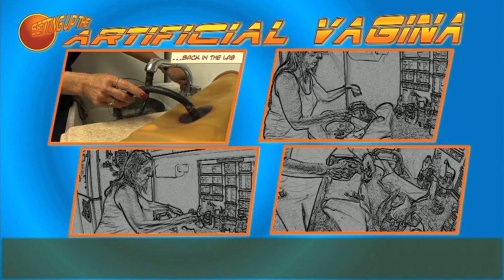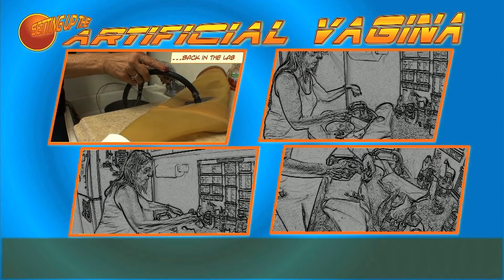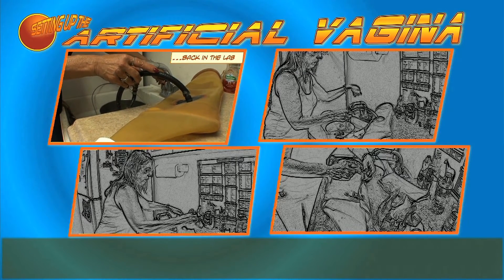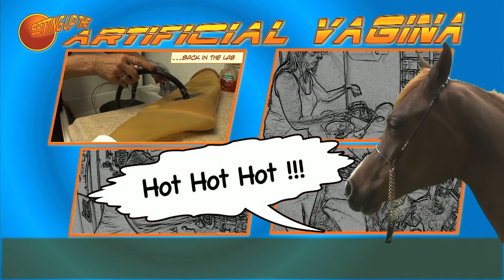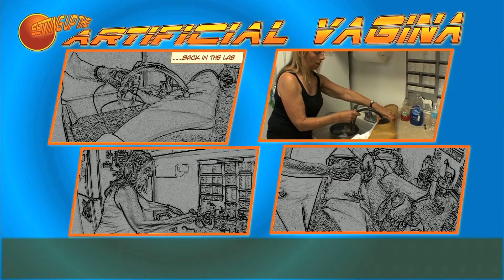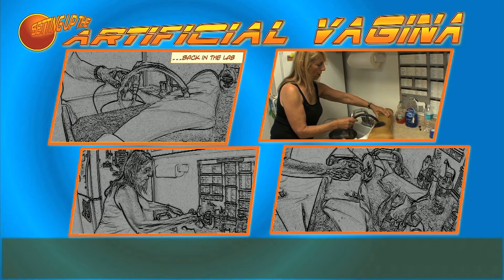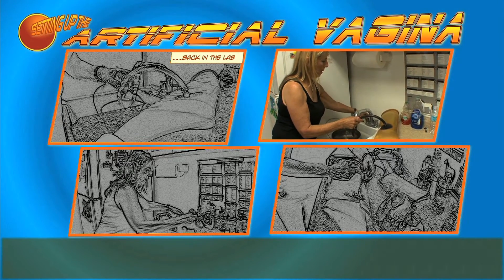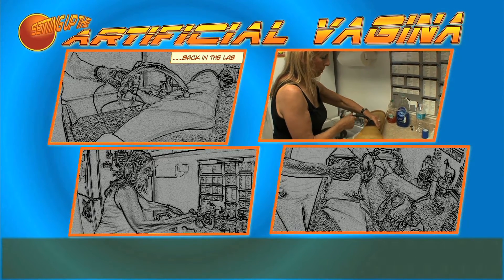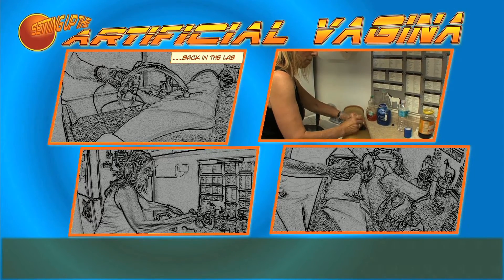The AV is a double bladder and the hot water fills it, heats it, and makes it firm. And then we're going to burp this — I'm going to hold it up and cover that. That's why we had those paper towels ready.